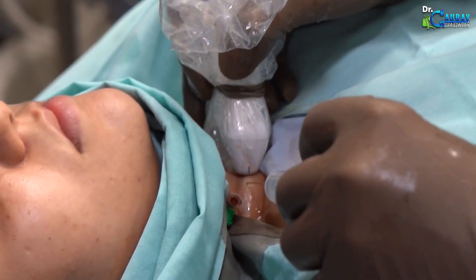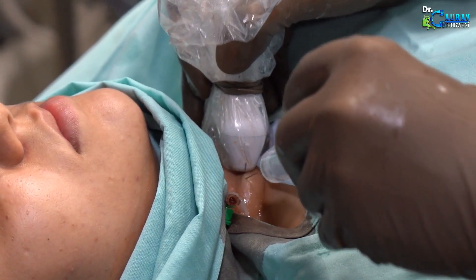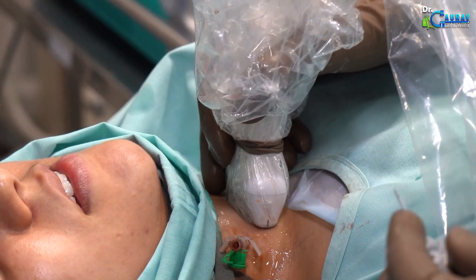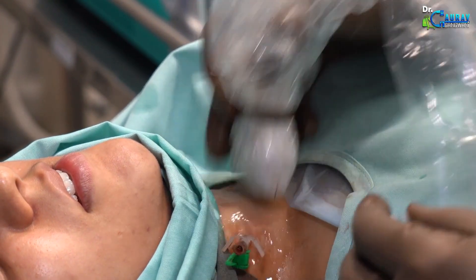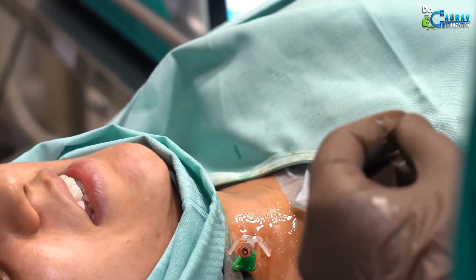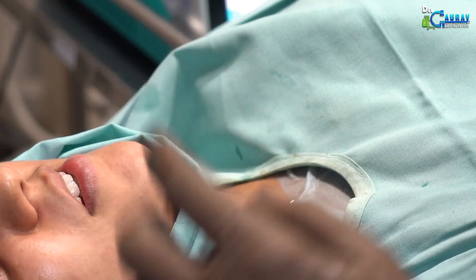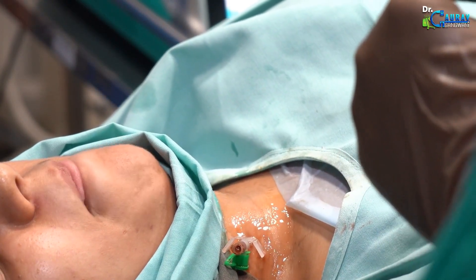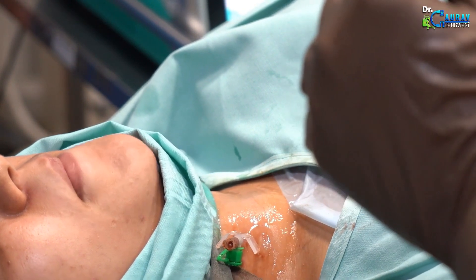We are bringing local anesthesia to both ends to ensure a pain-free procedure, and just as before, we will continue to communicate with the patient. It takes anywhere from 5 minutes to half an hour depending on the procedure. This is one procedure where our bonding with the patient becomes very good — we learn many things about our patients that we might not normally notice. Doctors don't talk much in the clinic.